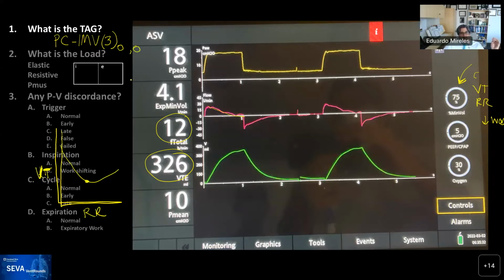And to implement that tidal volume, it uses an adaptive pattern. So it will adjust the inspiratory pressure to achieve that. The intelligent part that you all put, the I, comes because the makers of this mode essentially said, well, we want to keep the tidal volume within a range that it's protective, right? And so they said within this range of tidal volume, we want to stay because that would be what we know at this point protective.